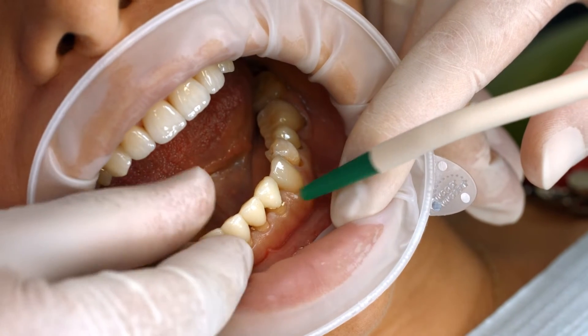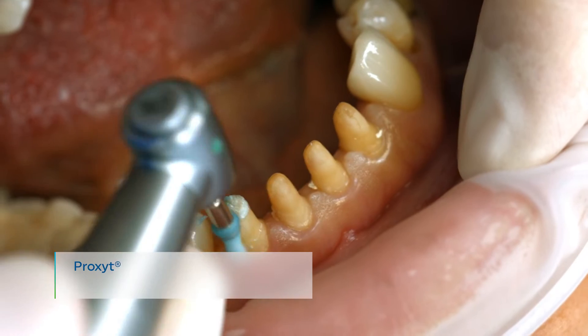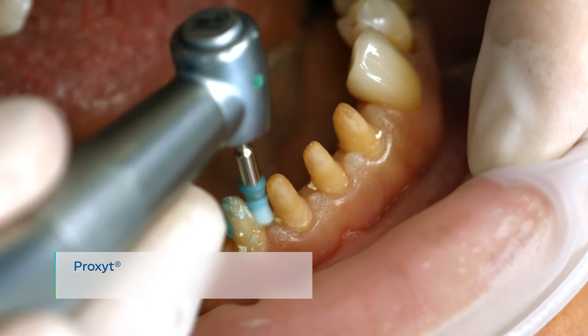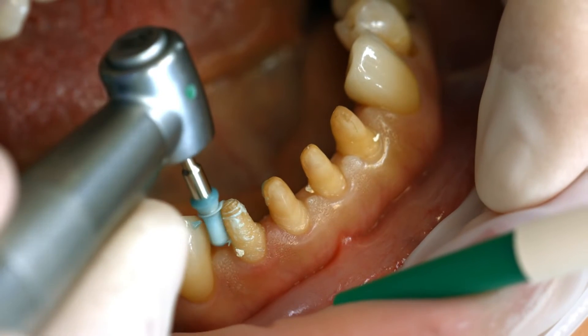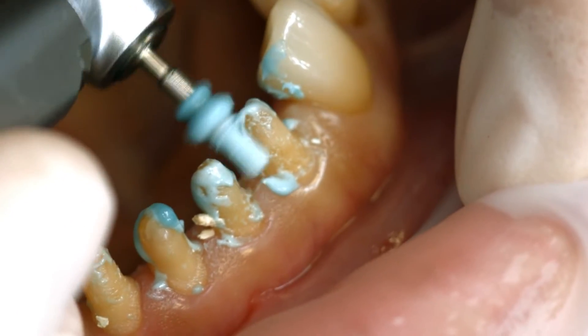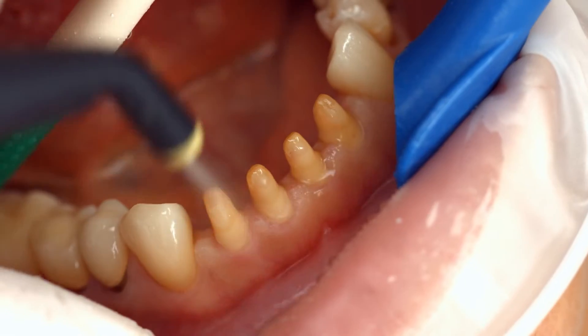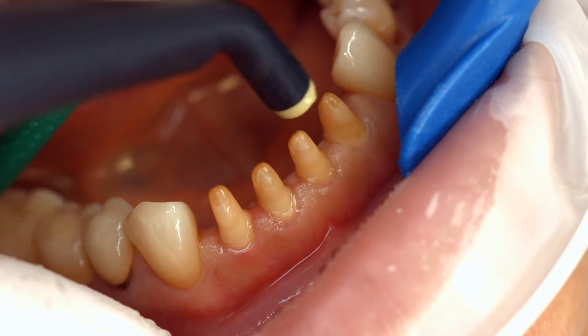Remove the temporary restoration. Clean the preparation with a polishing brush and a fluoride-free cleaning paste such as fluoride-free Proxit. This ensures that all temporary cement residues are removed. Rinse the preparation with water spray and dry it with water and oil-free air.